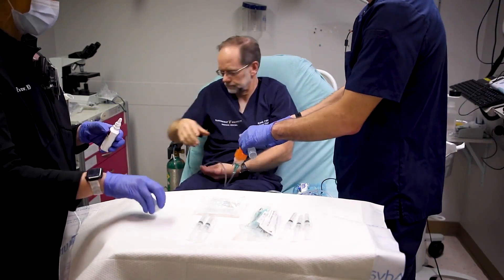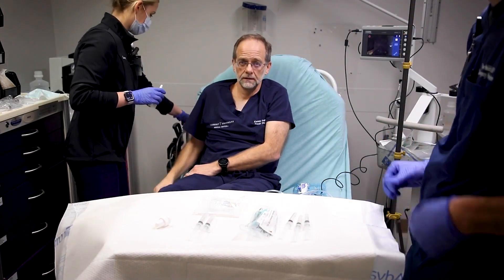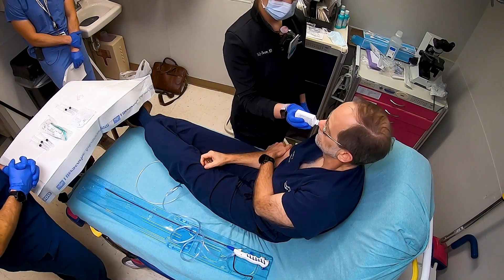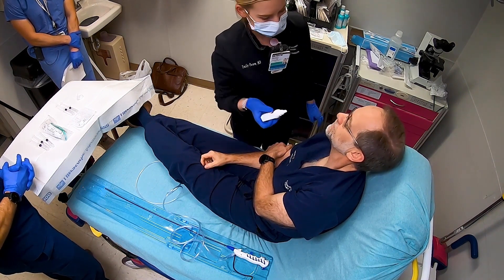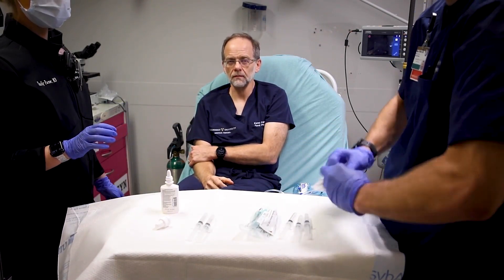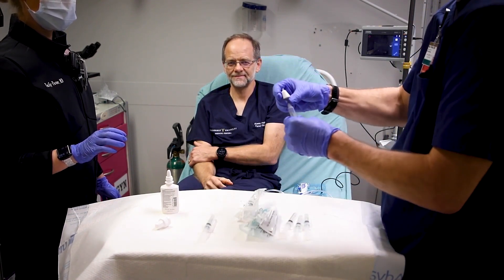The next step is to apply Afrin spray to the nostrils to reduce the rate of epistaxis. After giving Afrin, we'll go ahead and atomize 1 mL of 4% lidocaine into each naris.